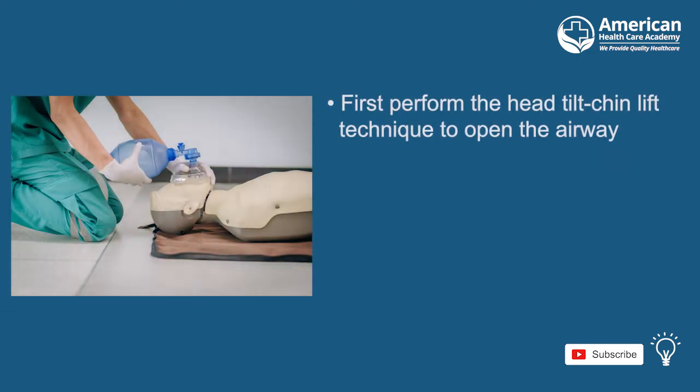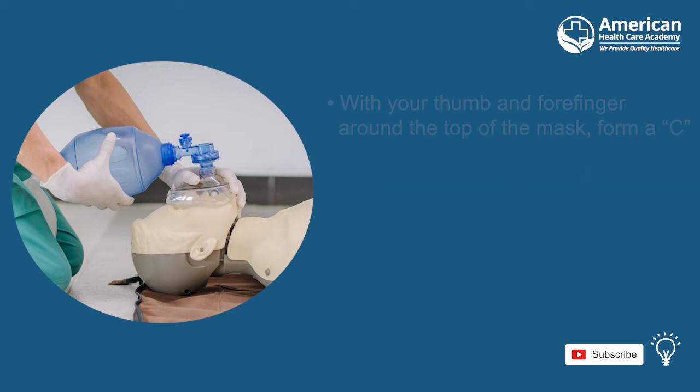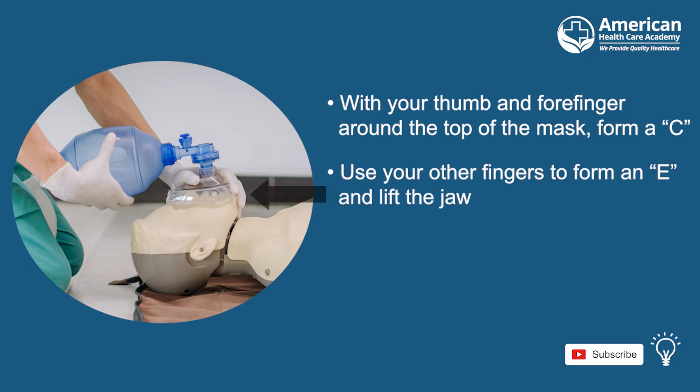When you practice this method, first perform the head tilt chin lift technique to open the airway, and as you do so with the mask in your hand, place the mask over the patient's mouth. With your thumb and forefinger around the top of the mask, form a C. Use your other fingers to form the letter E and lift the jaw. Sometimes this method of ventilation is sufficient. If it is not sufficient, then a basic airway must be considered.